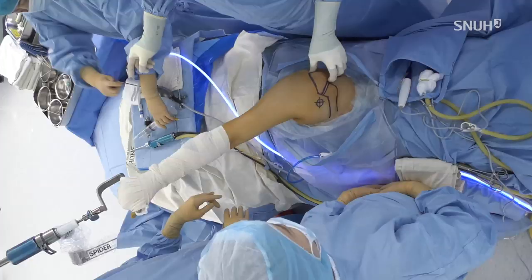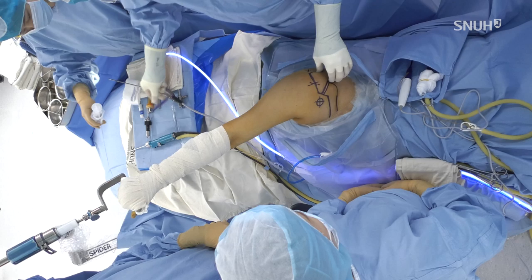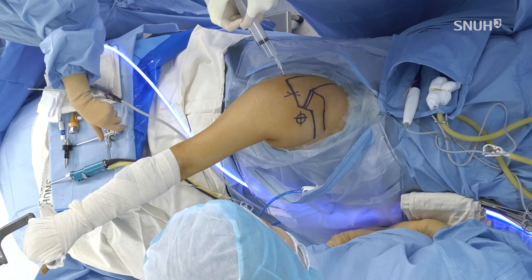For this SLAP repair, my routine posterior and anterior portals are the same, but the working portal for the SLAP lesion is through the transrotator cuff portal. At the beginning, I will inject normal saline into the glenohumeral joint to prevent cartilage injury.